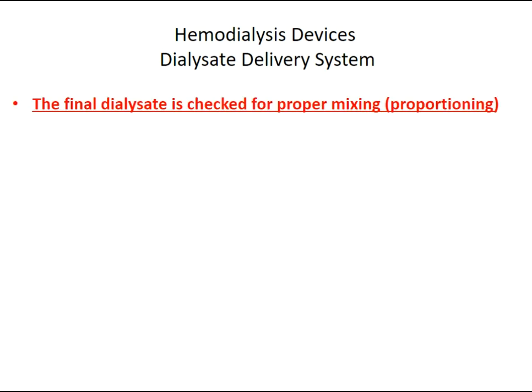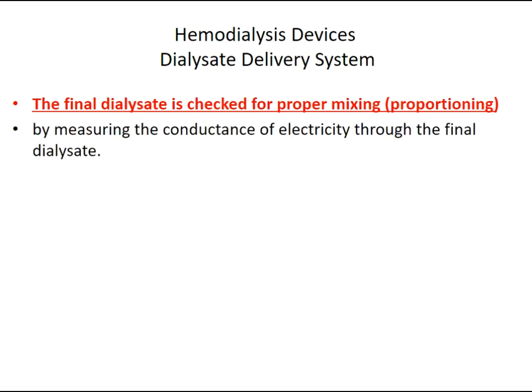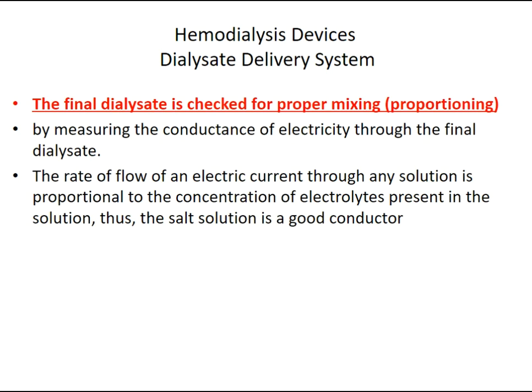The final dialysate is checked for proper mixing by measuring the conductance of electricity through the final dialysate. The basis of that is that the rate of flow of an electric current through any solution is proportional to the concentration of electrolyte present in it. So the salt solution is a good conductor.